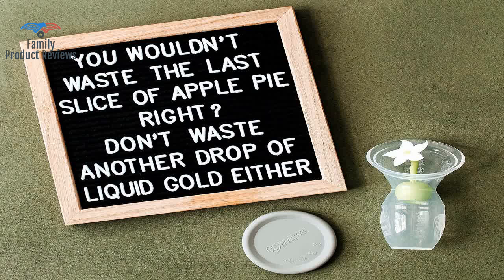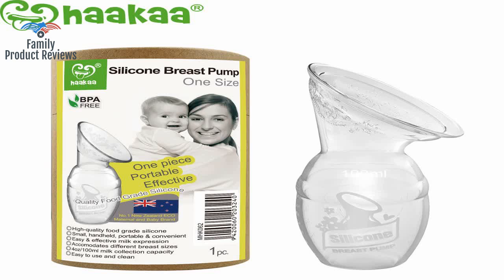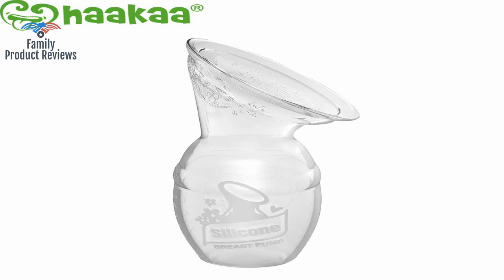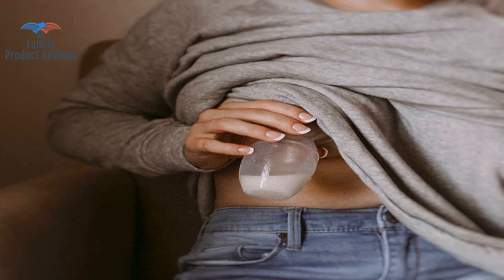If you are a leaker, it's a great product to catch all the milk from your letdowns while baby is nursing on the opposite breast. Please buy this for all of your expecting friends and yourself. Don't second guess yourself about it.